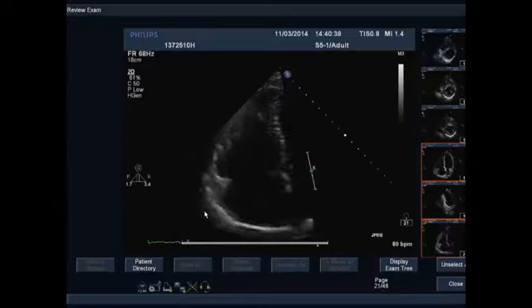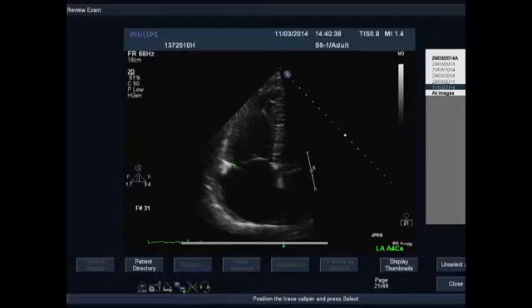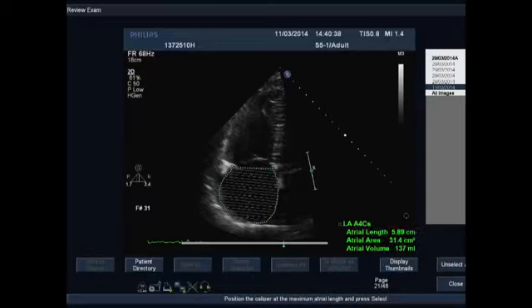And the right atrial dilatation is very important for the patient's prognosis and follow-up, as we know that it's a bad prognostic marker. So it is important to measure the right atrial volume from the four-apical chamber view, and in order to do that, we stop the sequence at end systole, and then we trace subsequently the right atrium, and then we modify the length to be more central, and the machine will use the method of Simpson's to calculate the right atrial volume.